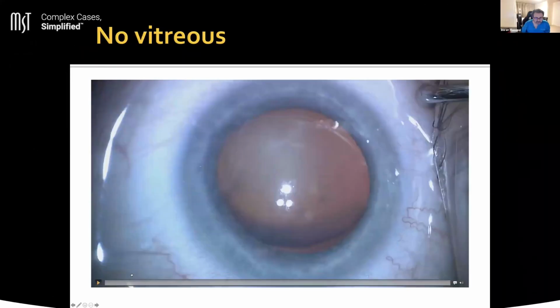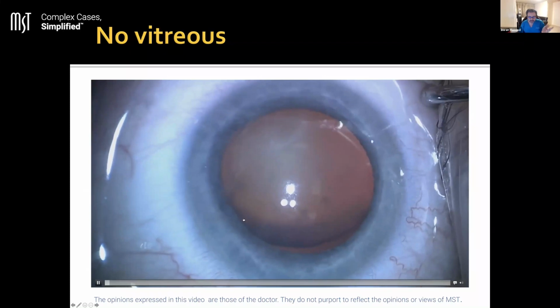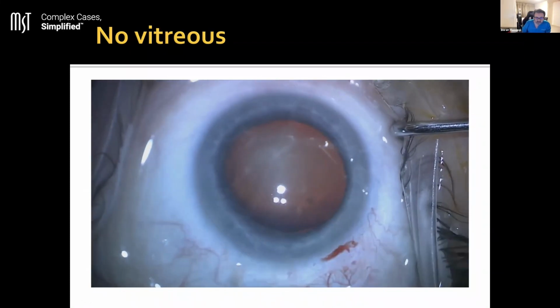What about if the zonulopathy is more severe? Now, this is a case of ectopia lentis, and you could hand this over to the VR surgeons and they could do a vitreolensectomy, but I actually think this is unnecessary.